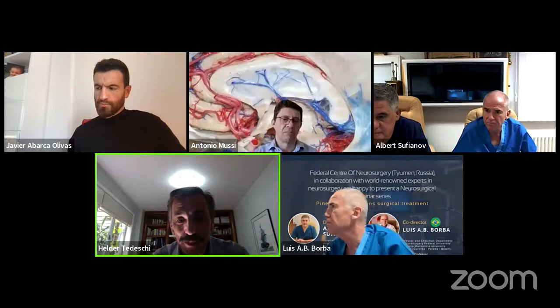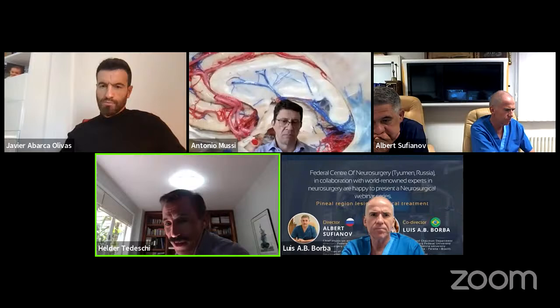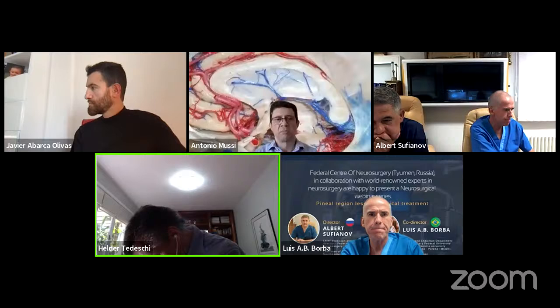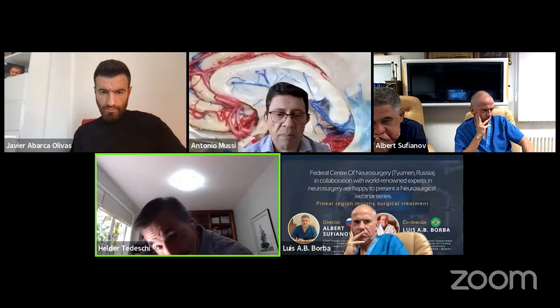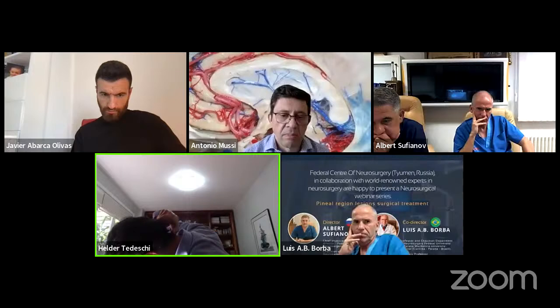And besides, look, you should not do this. You're looking at me? Can you see? Yes, I can see. So you cannot do like this with your head. If you place the patient like this, you have the neck too flexed. And then when you tilt, you have a compression here. So you're not operating supracerebellar, you're operating interhemispheric. So it's here, not here.